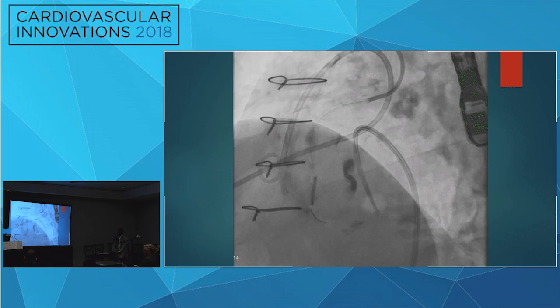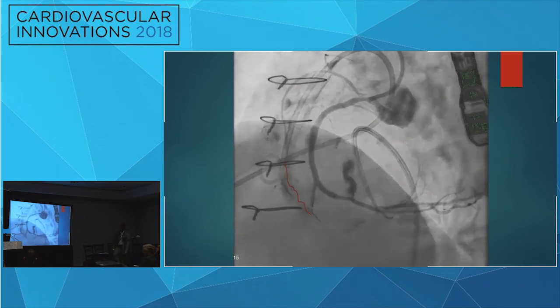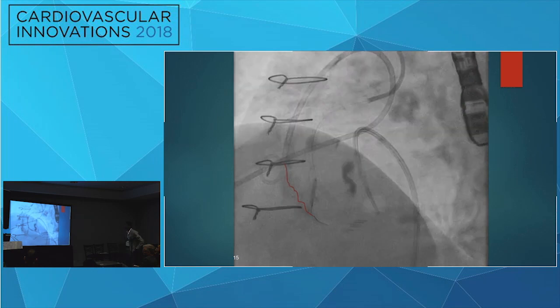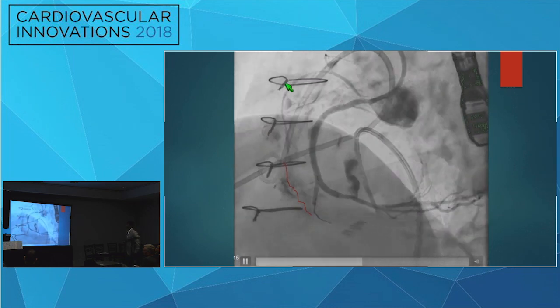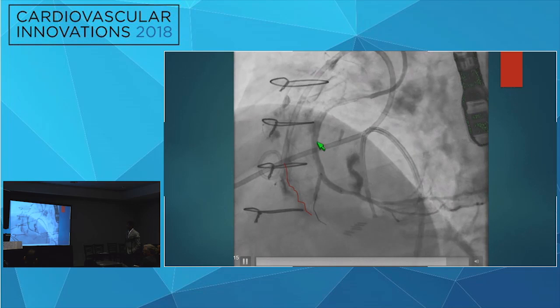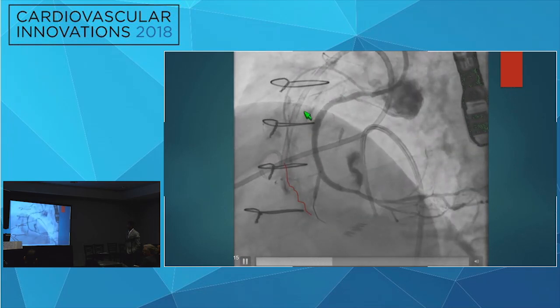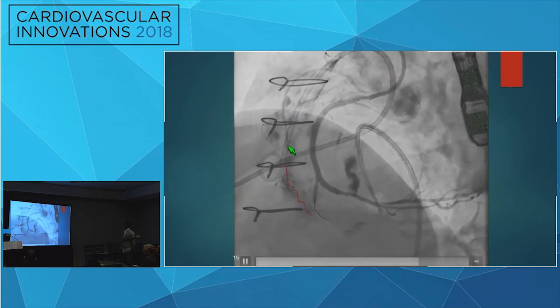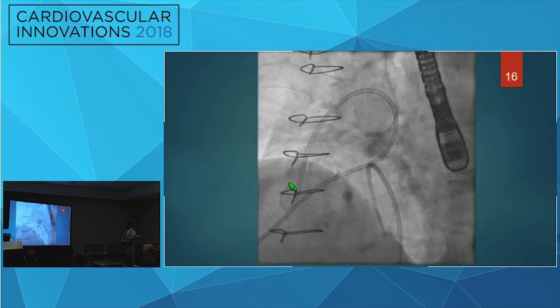Right. So it's a very good thinking. So this patient, it's important to notice in patients with chronic subtotal occlusion, I'm just showing this squiggly line here, just to show you the collateral that arises from here, and it goes all the way above to see the small branch down there. So this patient obviously had subtotal occlusion, and he developed bridging collaterals from the proximal distal branch, or between these two branches, and obviously that's another feeding source that you could expect causing your expanding hematoma even after trying to occlude your RV marginal branch.